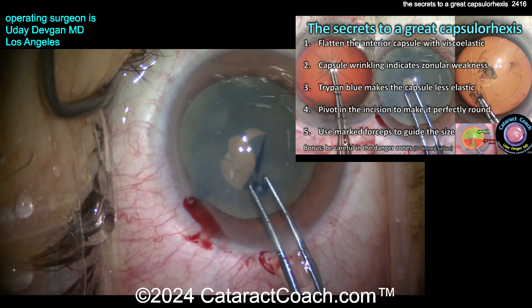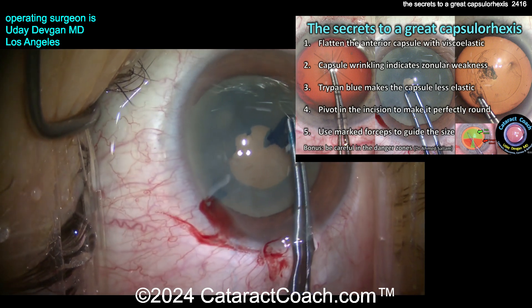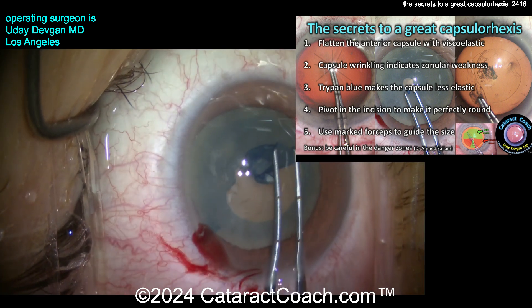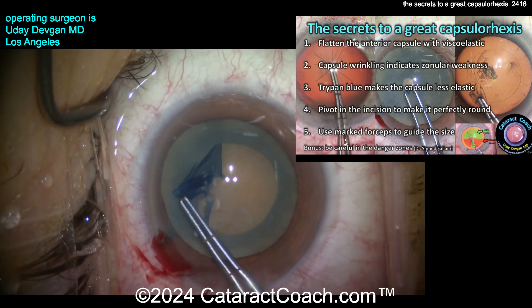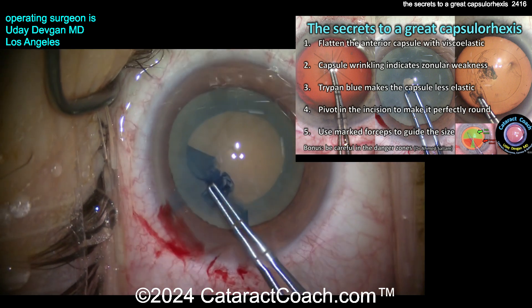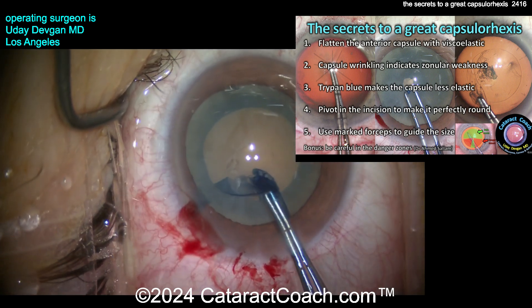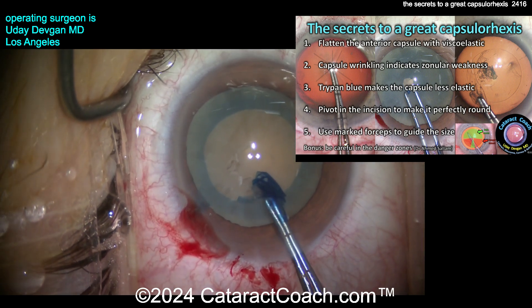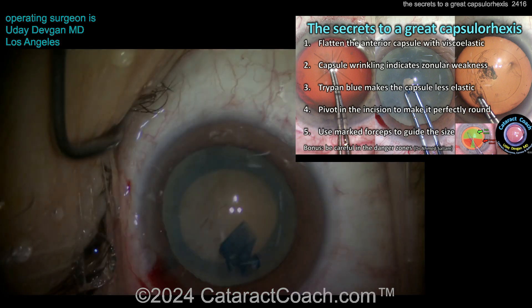Finally I'll get a good grab and get a good rhexis going. I knew this was not an intumescent white cataract, so I didn't have to worry about lens milk. Again, measuring out the rhexis with the forceps so I know exactly what I'm going to get. Good pivot, pivot, pivot — look at that pivot technique. That's the technique we use to make a beautifully round capsulorrhexis, nicely centered in the visual axis and beautifully round. That's going to look fantastic.